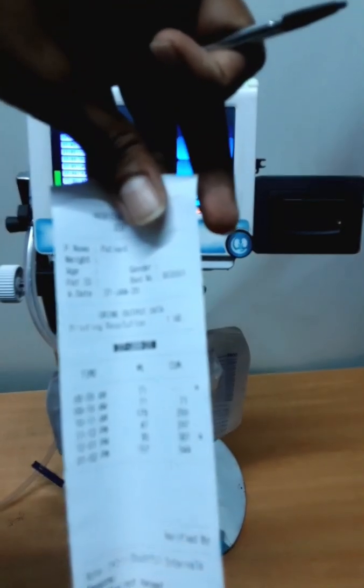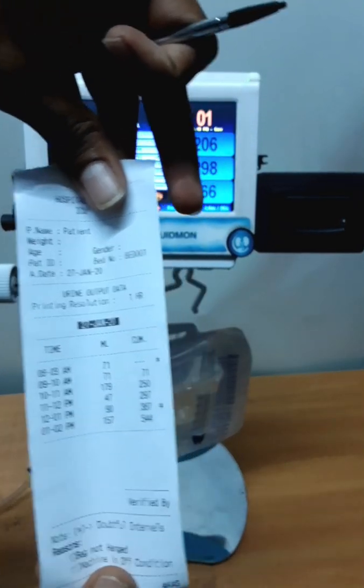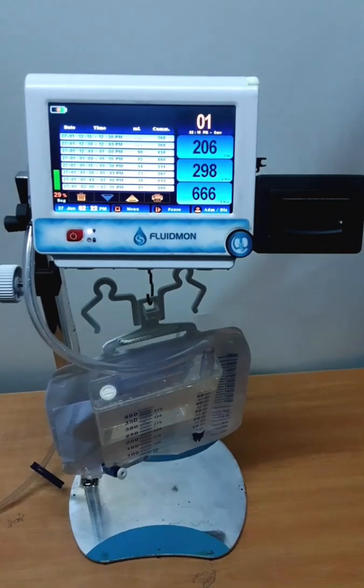See how easy it is to record the patient data. This is the advantage of our machine — you can use it user-friendly.